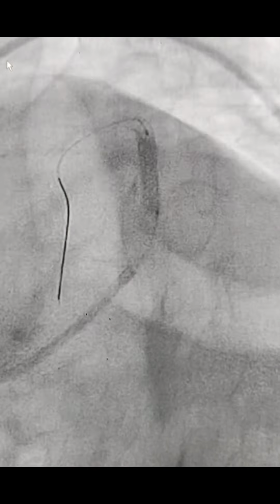So this is the placement of the stent. Whenever we deploy an ostium stent in the ostium LAD, then we need to check in the caudal view. So this was the positioning of the stent right from the ostium of the LAD, and then we deployed the stent here and everything went well. And then again we reinflated the stent in this view.